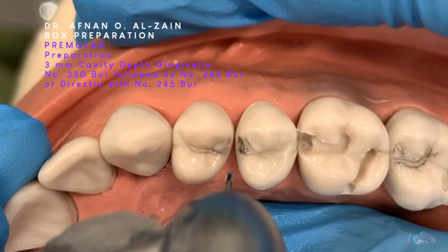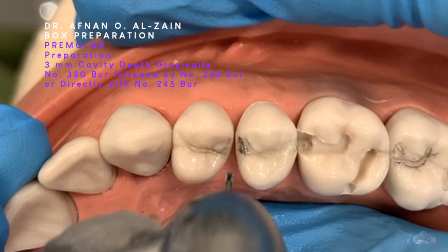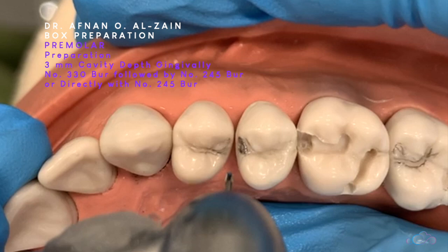To prepare the cavity, we can either use 3.30 in the beginning so that we can access the contact area, and we can enter to a depth of 1.5 mm so that we can add the outline.